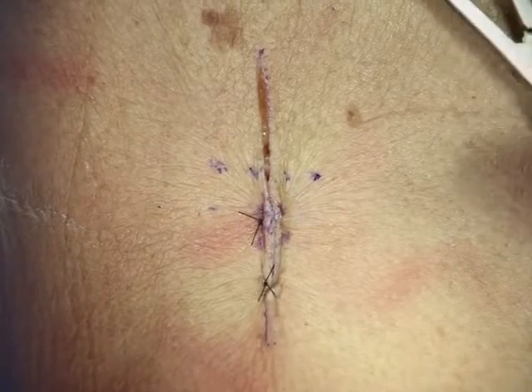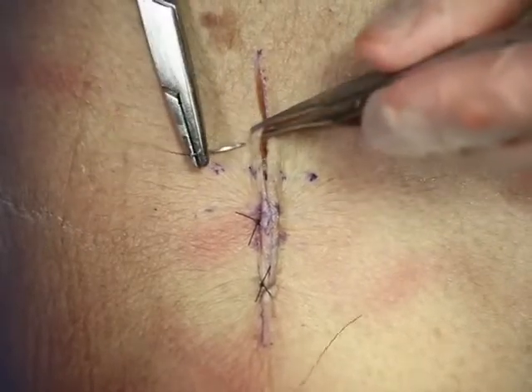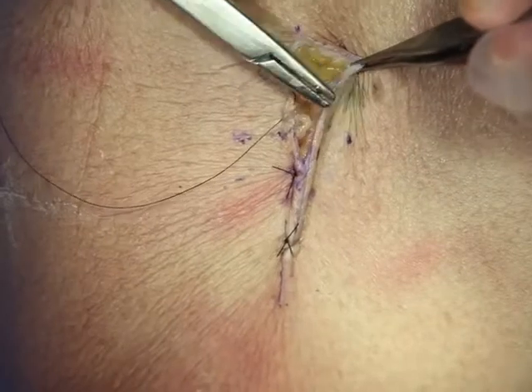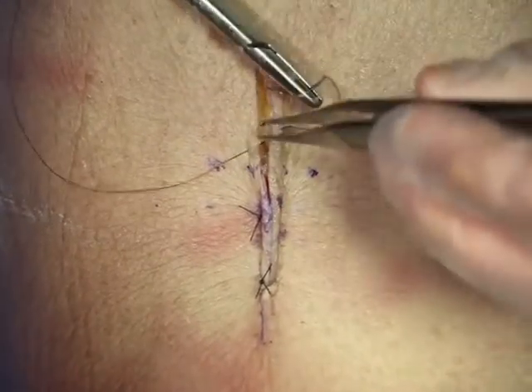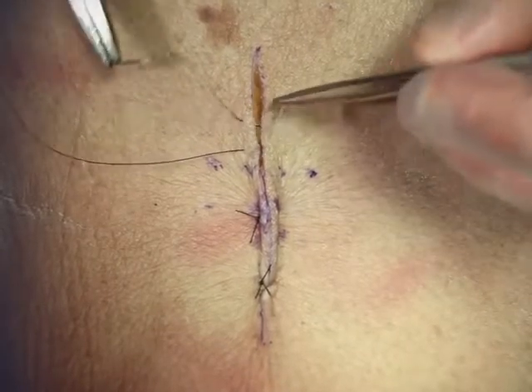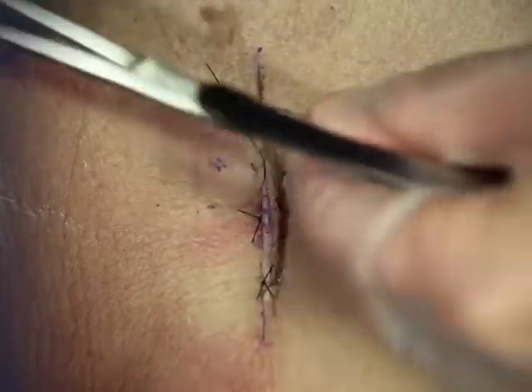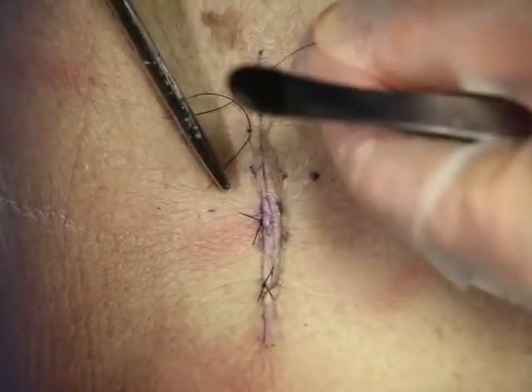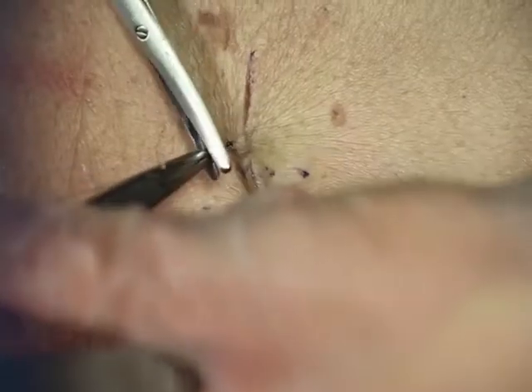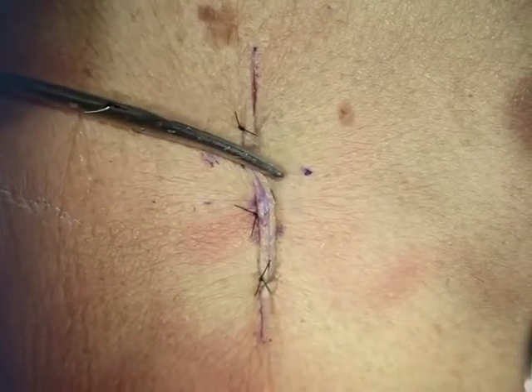The final variant of the horizontal mattress is called a half-buried mattress, which we use a lot in plastic surgery. If there's an area where you don't want suture holes, you can start your horizontal mattress on one side, and on the opposite side stay within the dermis in a horizontal, subcuticular fashion. Then come back on the other side as you would in a normal horizontal mattress. So effectively, it's your horizontal mattress but half of it is buried — hence the name half-buried horizontal mattress. When you tie this, it secures the skin and you only have suture marks on one side. We do this when there's a hair-bearing and a non-hair-bearing area, to hide suture marks, or when we're worried that sutures at the tip of a flap will interrupt blood supply.